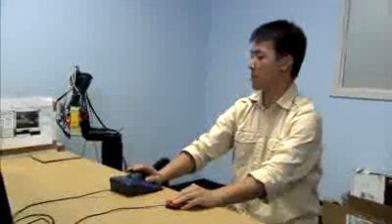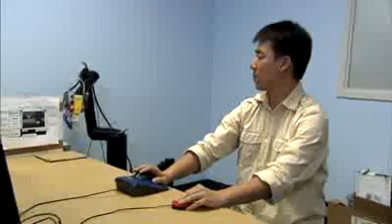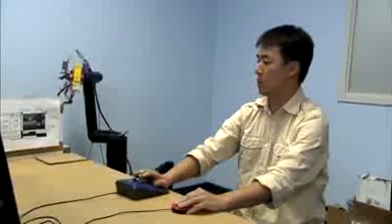Study results will help determine which candidates may benefit the most from this technology and which software makes using the robotic arm most effective and efficient for independent living. I would like to think that once this project shows benefits, that others will take it further and actually start to attach them to powered wheelchairs and maybe make them someday in the future a standard part of a powered wheelchair for a patient with a cervical spinal cord injury.